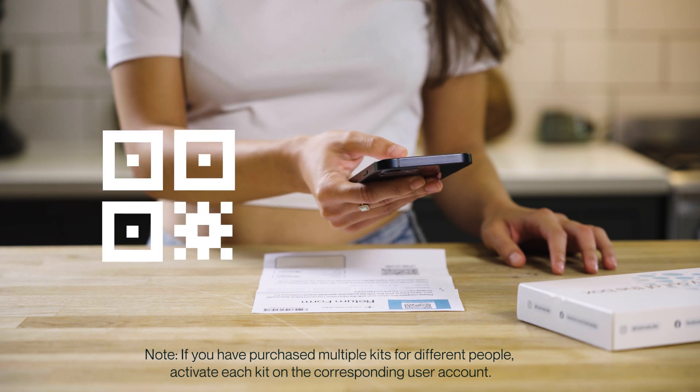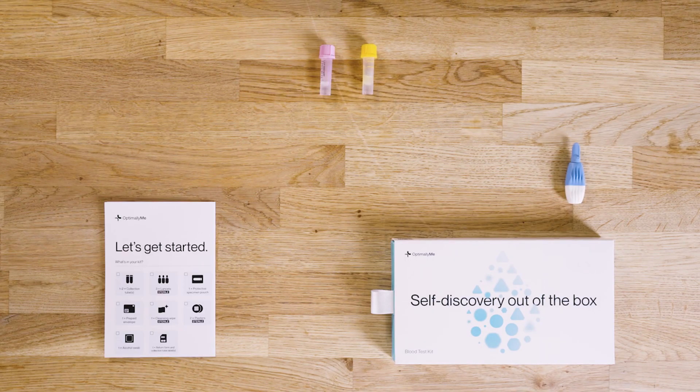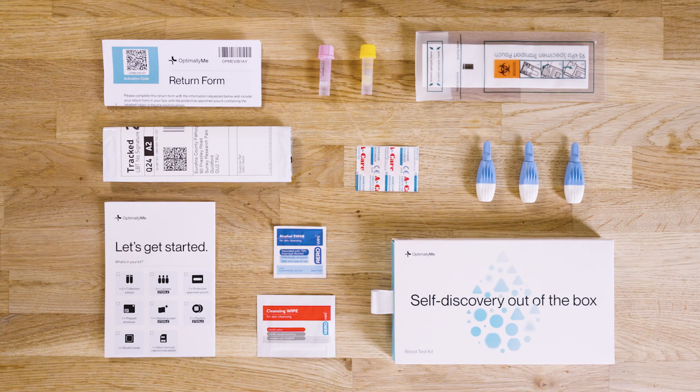Firstly, activate your kit by scanning the QR code or visiting optimallyme.com/activate. Lay out all the contents on a clean surface and tick off each item on your instructions.